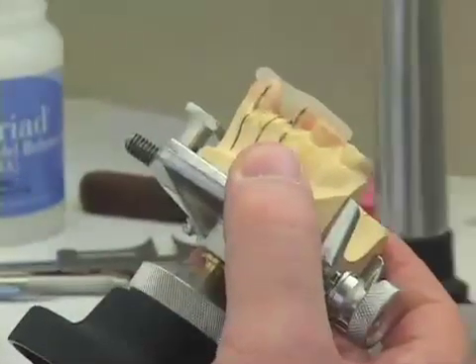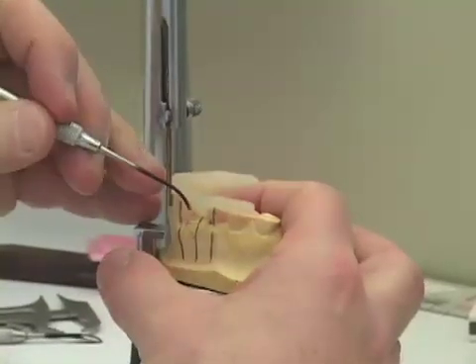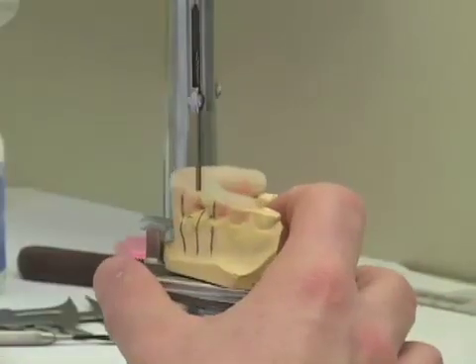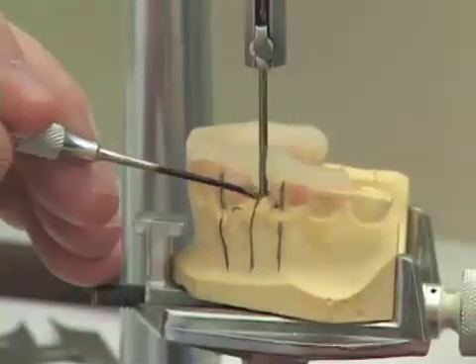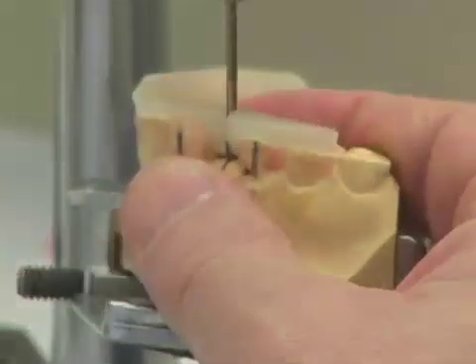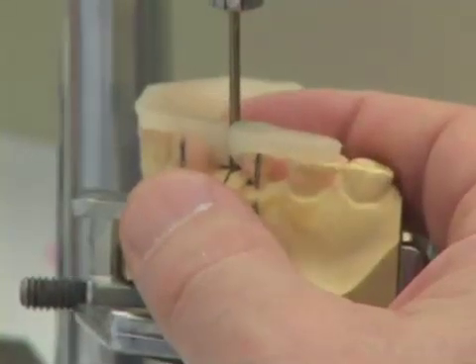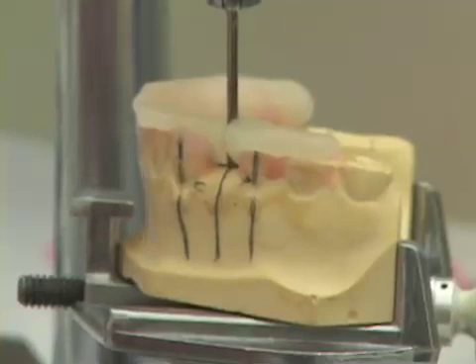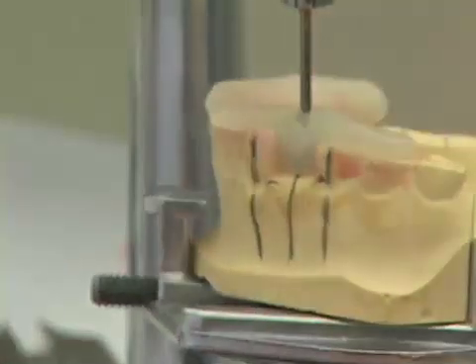Now I come back in with the surveyor, remembering that in the center of the crest of the ridge I have the depression indicating where I want the implant placed. I position the 2mm drill so that its end is right in that depression, keeping the surveyor table in place and pressing gently from the lingual. I use a buffalo knife to press down occlusally, getting the triad to adapt nicely around the drill blank. I then take a small additional amount of triad, form it into a small sphere like a pea, place it on the buccal or labial aspect, and press it firmly against the drill.